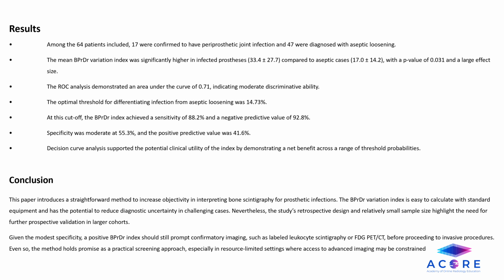And given the modest specificity, a positive BPrDr index should still prompt confirmatory imaging, which should be interpreted by a board-certified nuclear medicine physician. And some of those imaging modalities which can be used are things such as labeled leukocyte scintigraphy or FDG PET-CT before proceeding to invasive procedures or advanced management plans. Even so, the method holds promise as a practical screening approach, particularly in resource-limited areas where access to advanced imaging may be constrained.